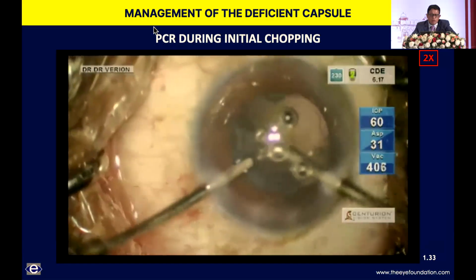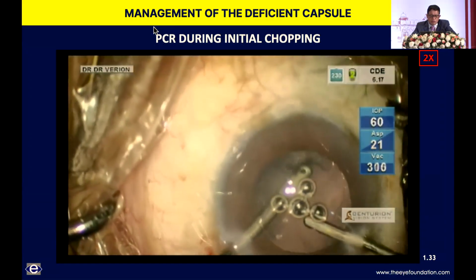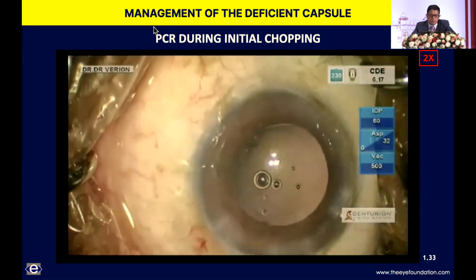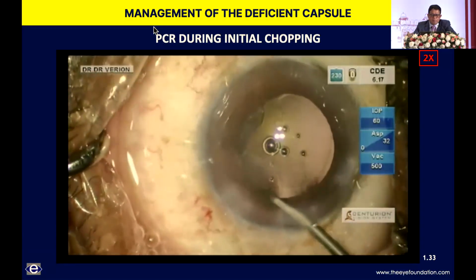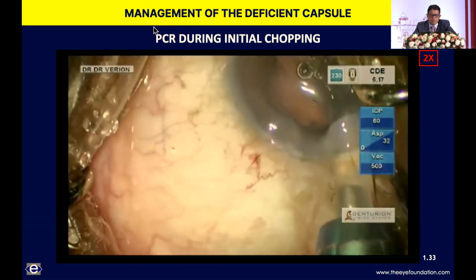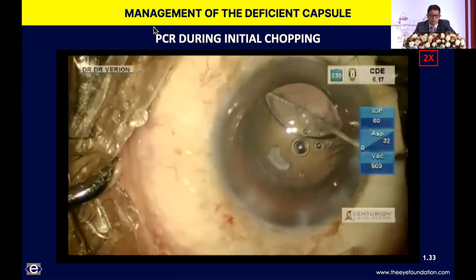But as of now, all the nucleus seems to have been removed, and irrigation aspiration is also completed. Make sure, using the Weck-Cel sponge, that there is no distortion of the rhexis margin or the pupillary margin. That itself tells me that there is no vitreous in the AC. Because initially the patient was to receive a single piece lens.